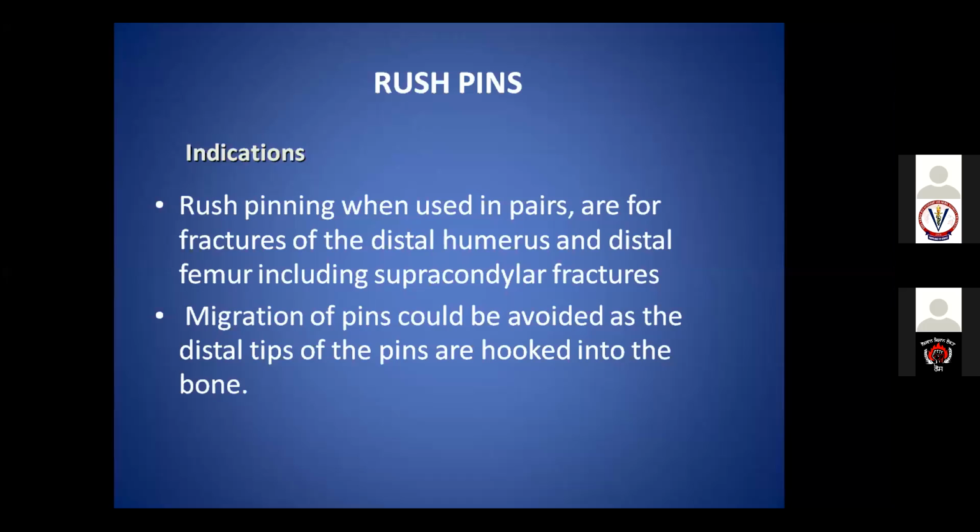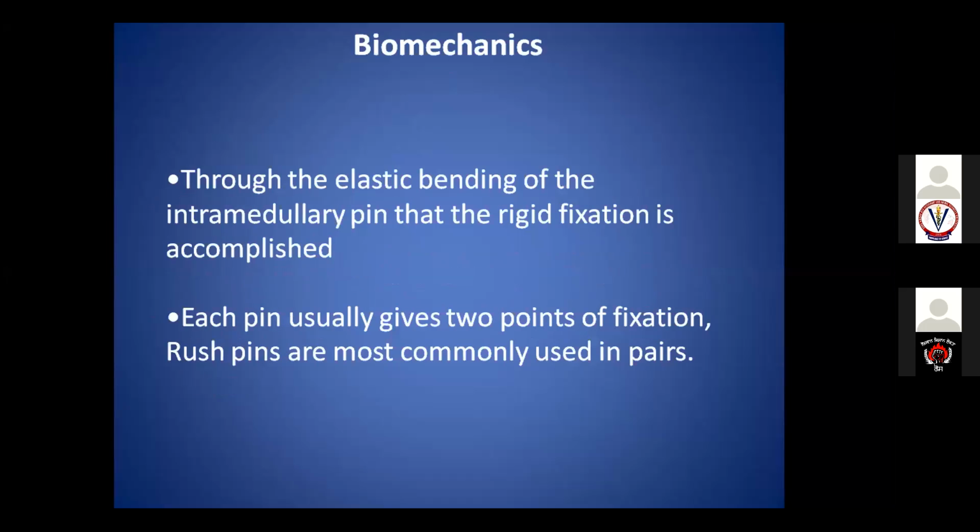What we do is we usually turn the one end of the pin towards the outer cortex of the bone, so that we are preventing migration of the pin in one direction. Let me show you the X-rays.